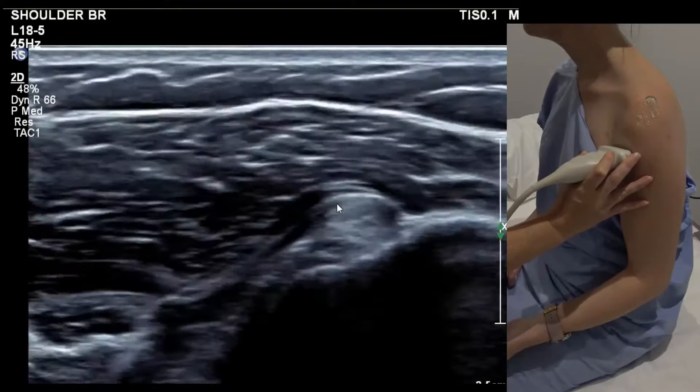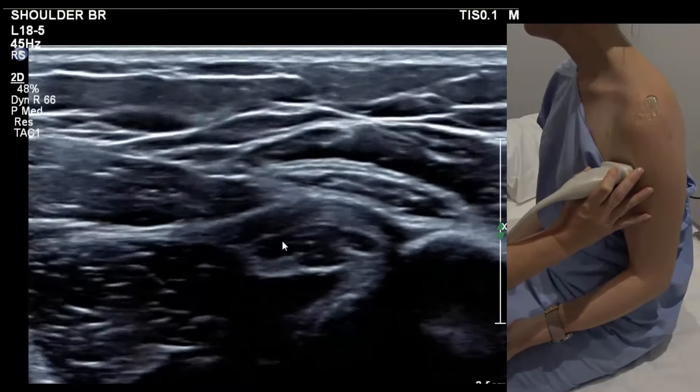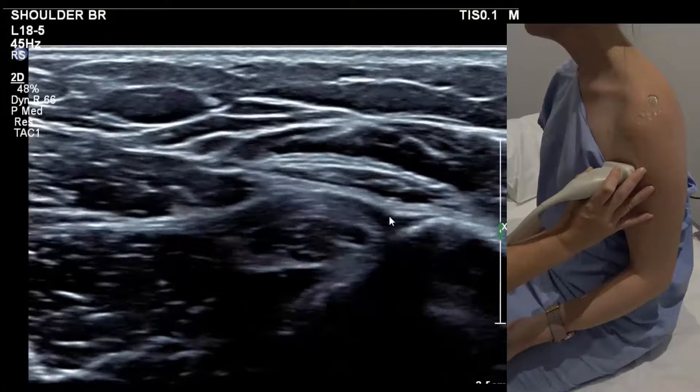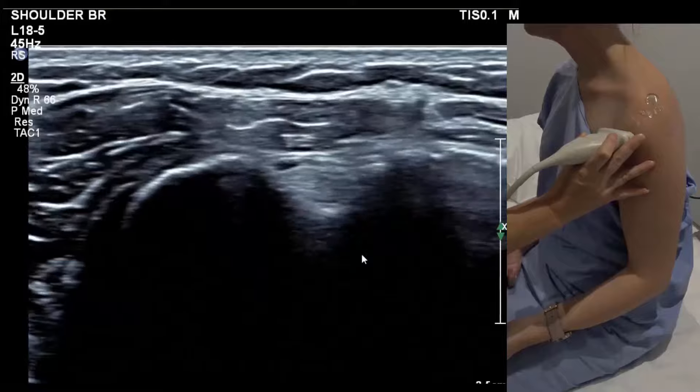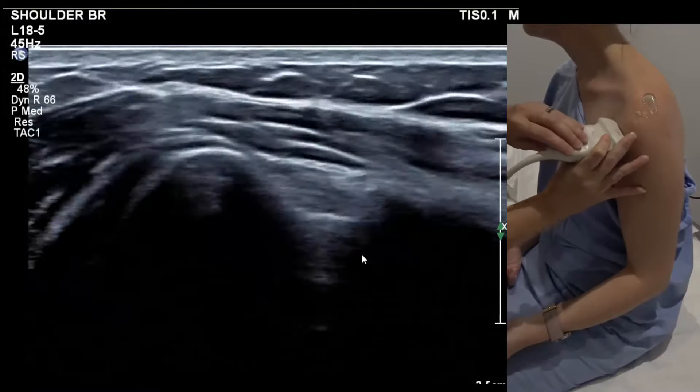Then we run down looking for an effusion. You can go as low as the pec insertion — that's the pec insertion there — and come back up. We'd image it up high in the groove, down low, and then also in longitudinal.